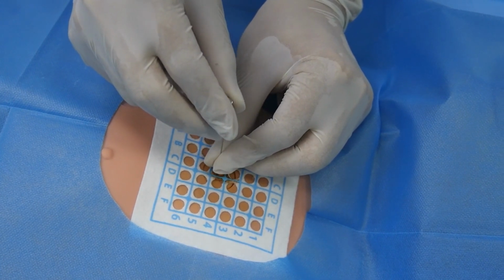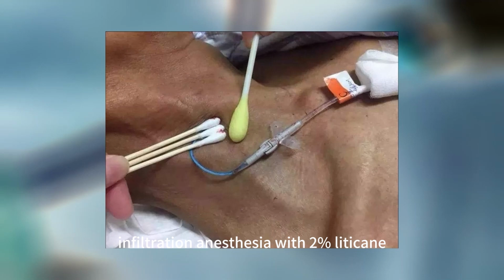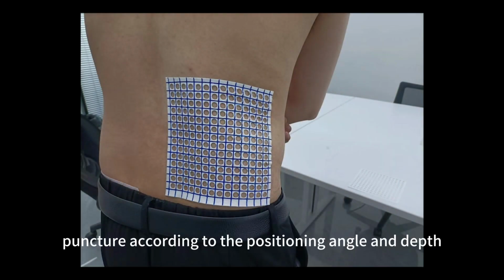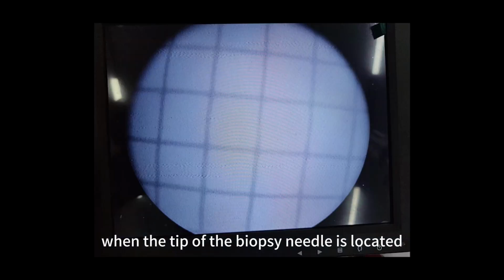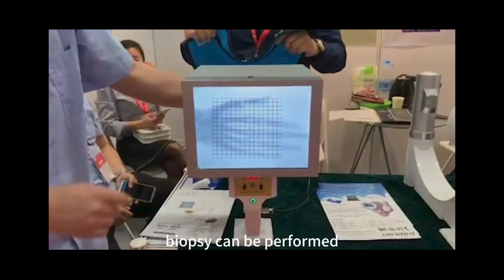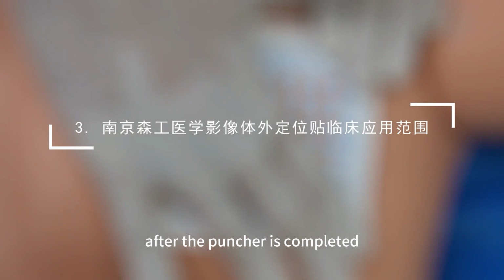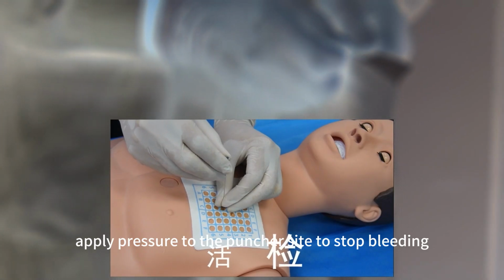6. Local infiltration anesthesia with 2% lidocaine to treat the pleura. Select a suitable biopsy needle. Puncture according to the positioning angle and depth. When the tip of the biopsy needle is located inside the edge of the lesion, biopsy can be performed. 7. After the puncture is completed, apply pressure to the puncture site to stop bleeding.